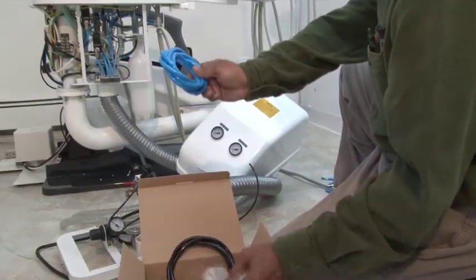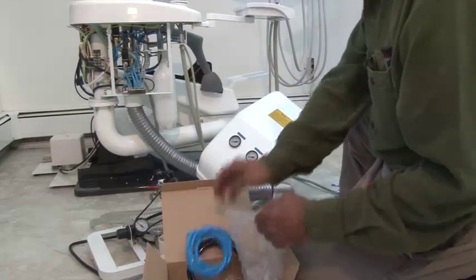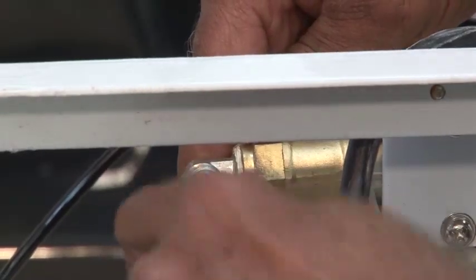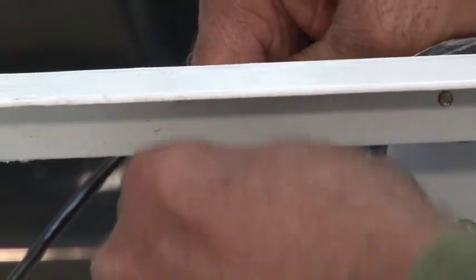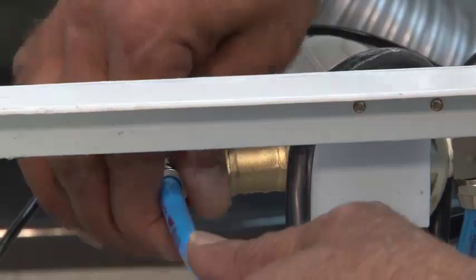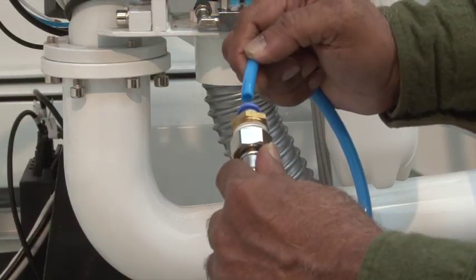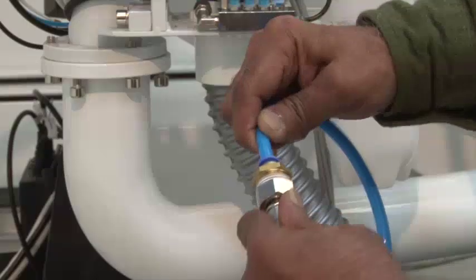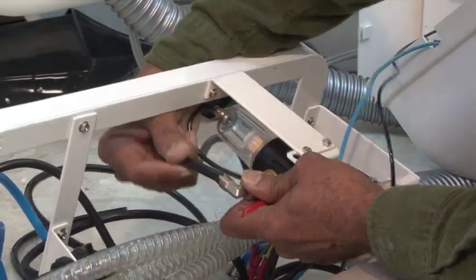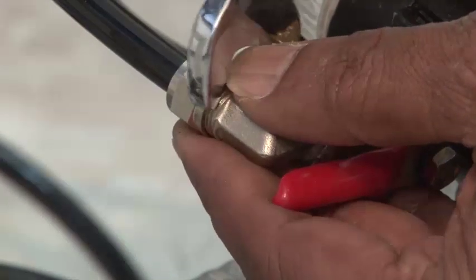Take the blue and black tubing provided in the accessory kit along with the half-inch quick connector. Connect the blue tubing to the water line and tighten the screw. Using the half-inch quick connector, connect the blue tubing to the water line. Connect the black tube to the air connector and connect it to your external air supply.